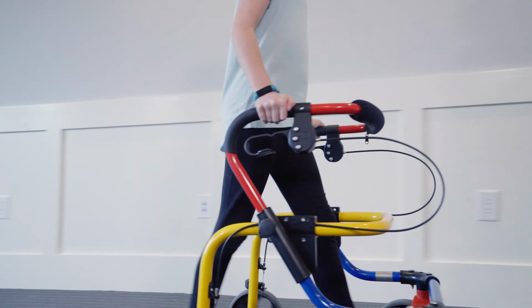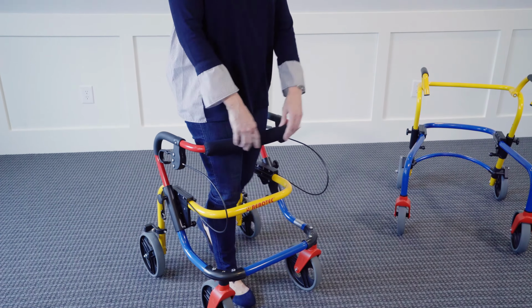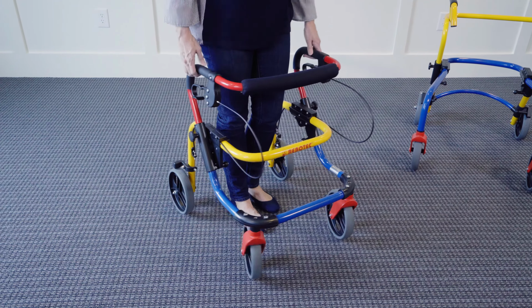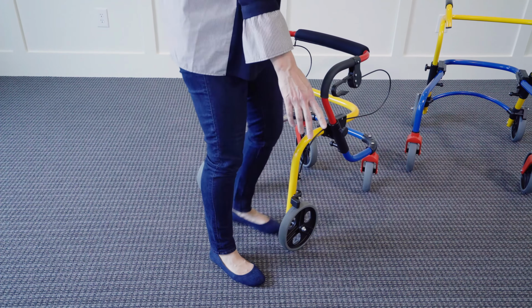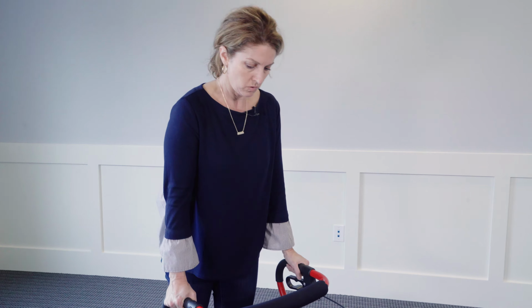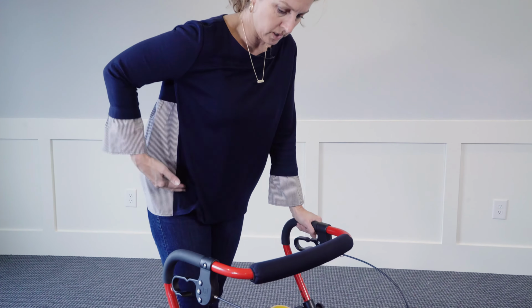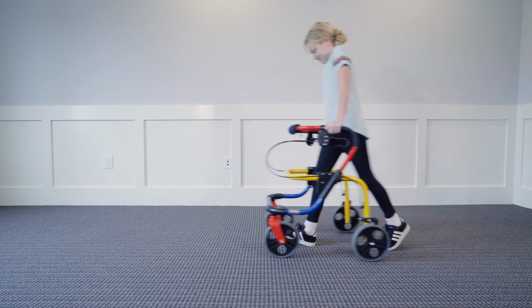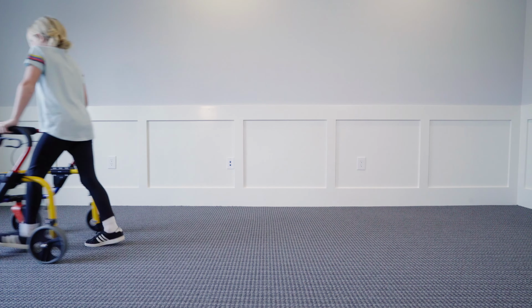As you can see with the anterior walker, you can't freely access your environment exactly because the walker's in the way. I mean, it's easy enough to turn it and step out of it, but long term, however, when you're in an anterior walker, you do use more hip flexion and your trunk is more flexed, usually about 12 degrees or more. Short term, however, these anterior rollator walkers are great.